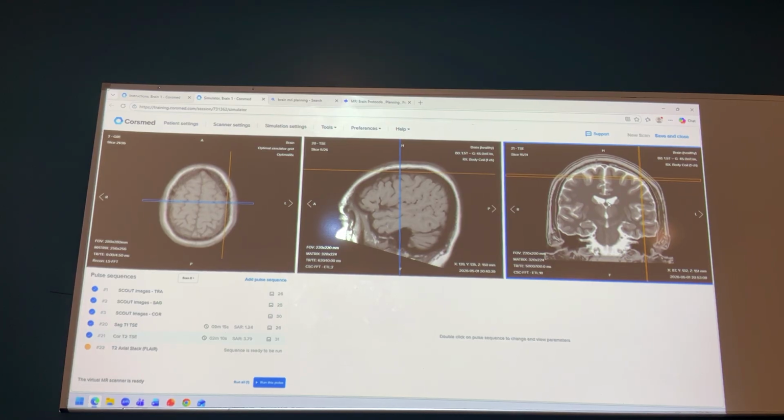And what image are you drawing? Include your slices in the image.